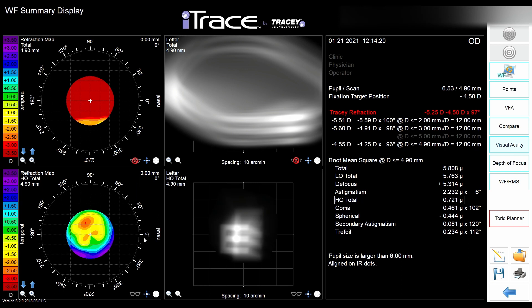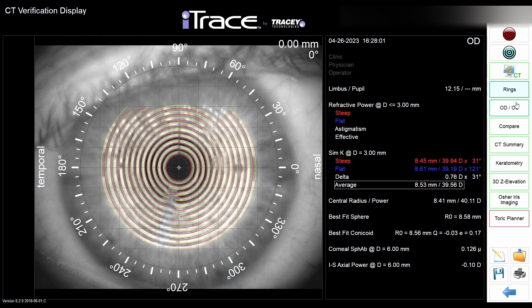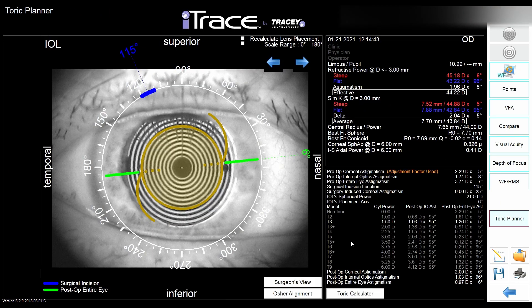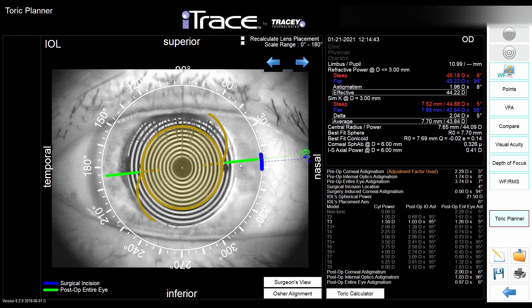This machine also gives you Placido rings so you can see the tear film. In the latest upgrades — which we don't really have — you can get a tear film index for dry eye. There's also a very easy-to-use toric planner where you can see where to place your incision, how large the incision is, and see the axis — available for multiple commonly used lenses.